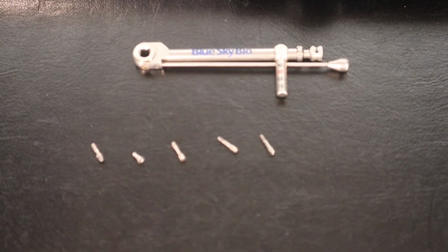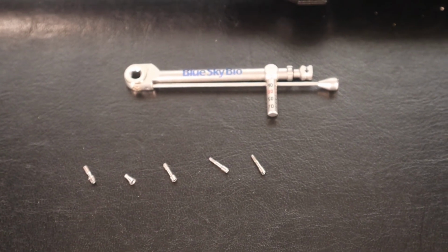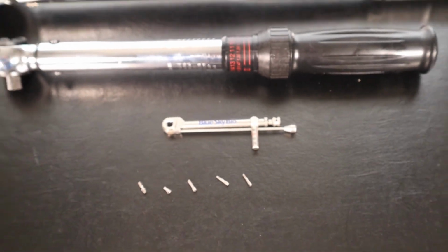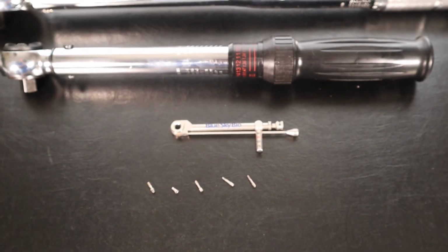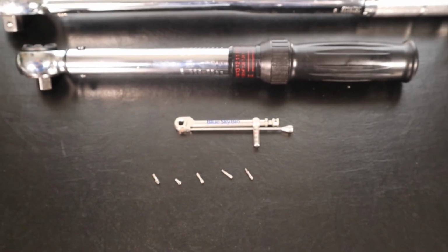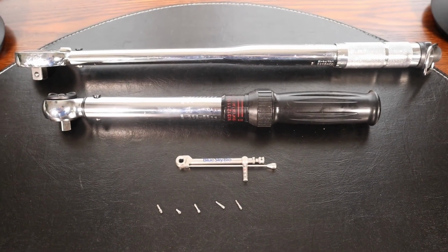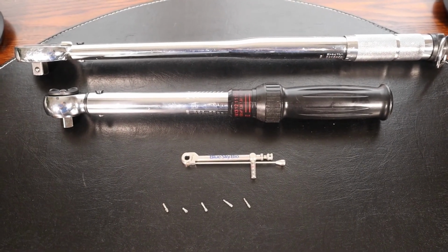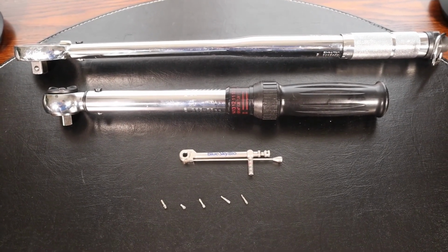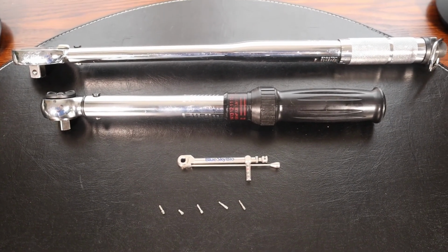To give you a difference in sizes between my dental torque wrench, right behind it I have my inch-pounds torque wrench. That's the one with the black handle, and then behind that is my foot-pounds torque wrench. Quite a size disparity. Then again, the screws that we use on dental implants are much smaller compared to a typical nut or bolt you'll see on a car.